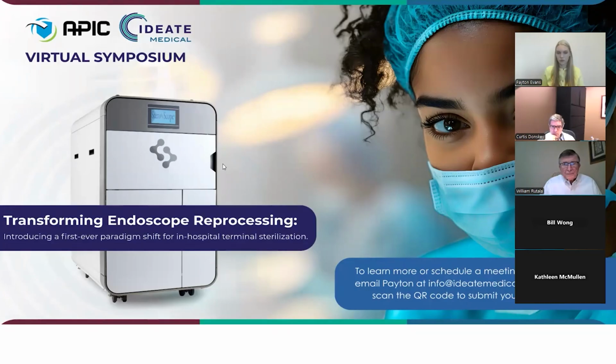Typically, all the VHP sterilizers or hydrogen peroxide sterilizers have to pass a validation test that is submitted to the FDA that shows that the system's safe to use. That's when you open the door. Your byproducts are typically water, vapor, and oxygen. So you have to show that there's no residual peroxide vapor literally left in the system. And basically, that's a standard requirement. So our byproducts are oxygen and water vapor.